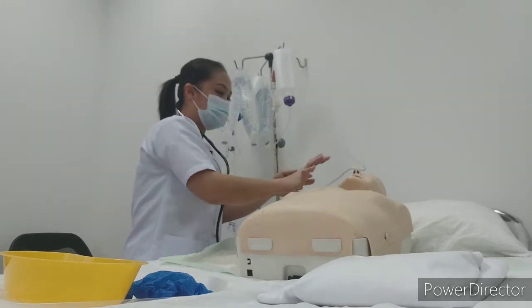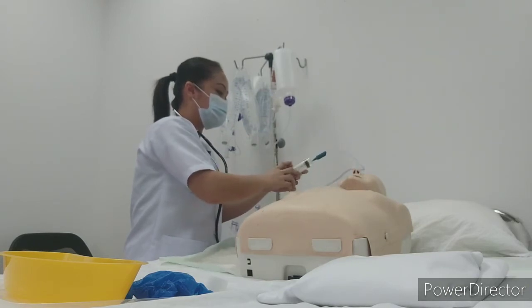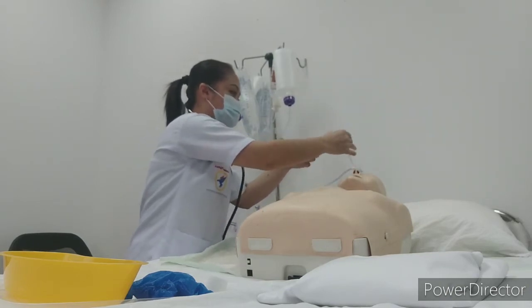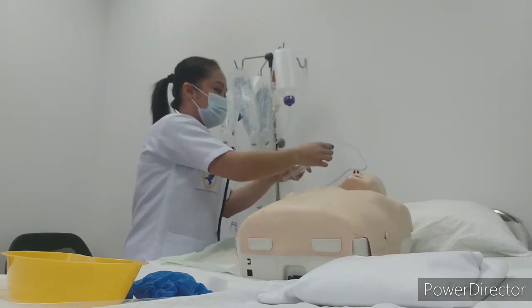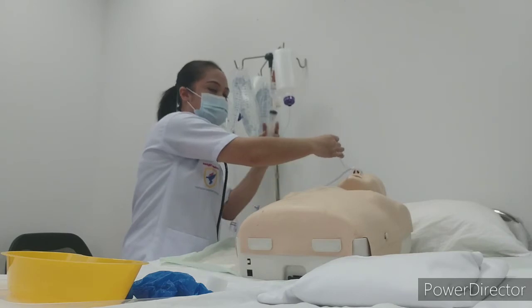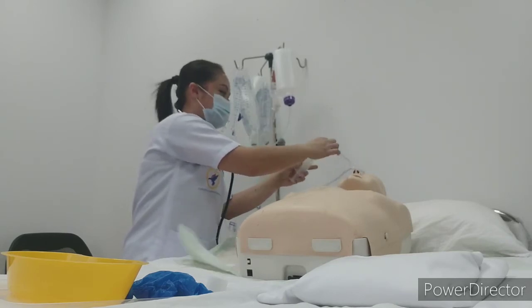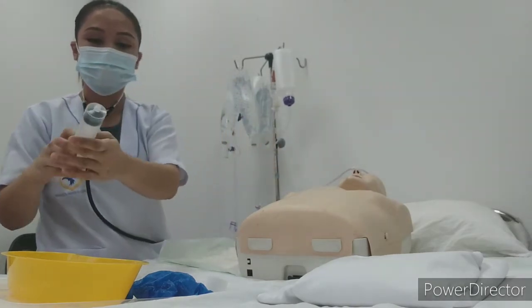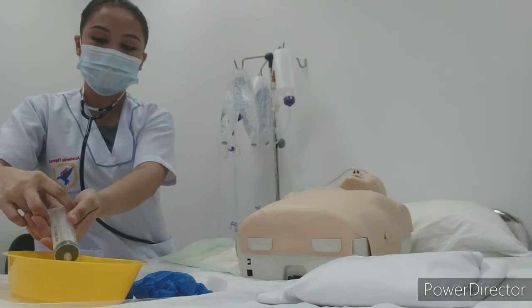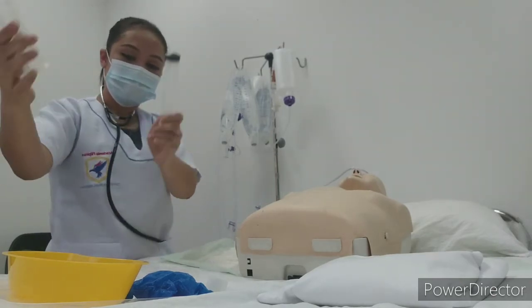So if like this, it is okay. The tube is inside the stomach. So again, we will disconnect the gastric fluid. Then after we will disconnect, dispose the gastric fluid. Pinch and close. Then set aside. This one, the gastric fluid, we will dispose in the kidney basin, and then we will separate the plunger. Okay. Set aside.